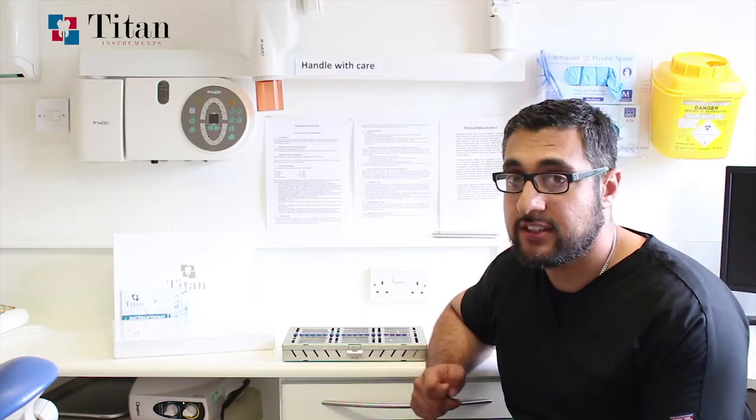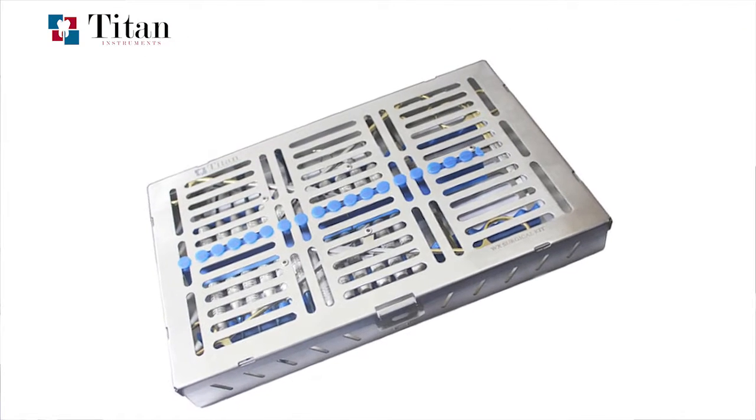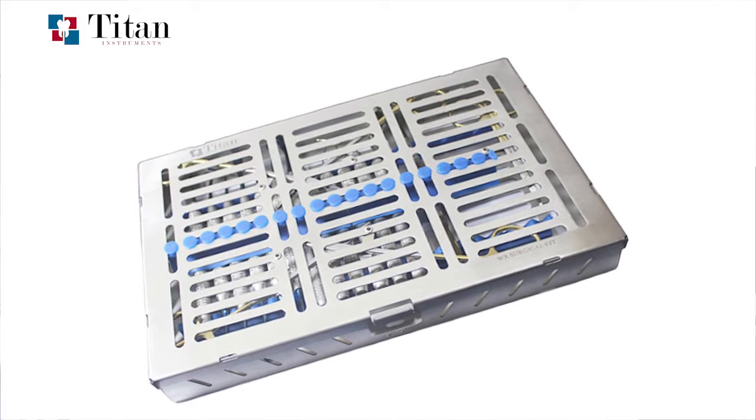So I started working with Titan Instruments to create a kit where all of the hand instruments are within a single cassette, making it not only easy for the dentist and surgeon to use, but also easy for the nurses to arrange, put away, and sterilize. Let me introduce you to the WX surgical kit itself.